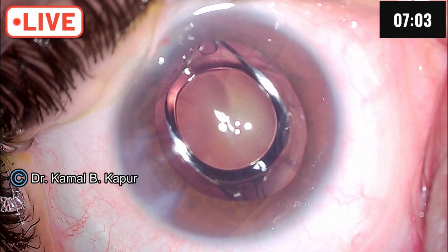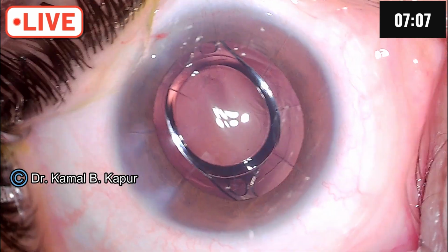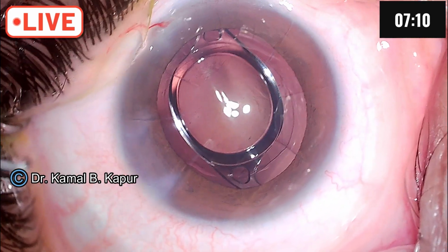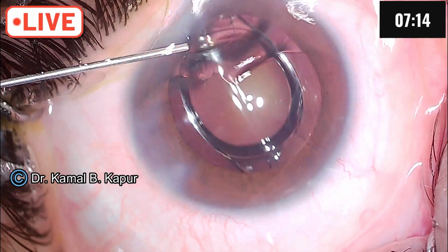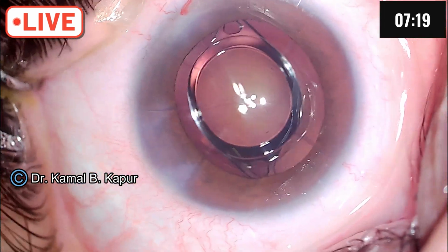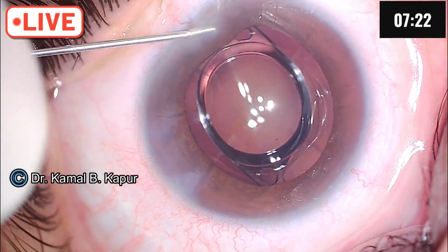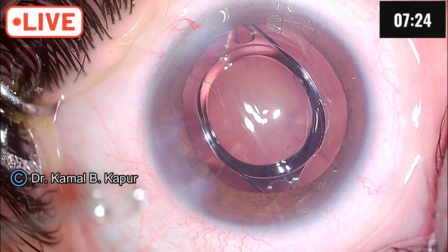And there you are. Now the final caveat here is, normally when you hydrate your wound, you should be very gentle. You should hydrate your wound very gently, no overhydration because it can spread over.